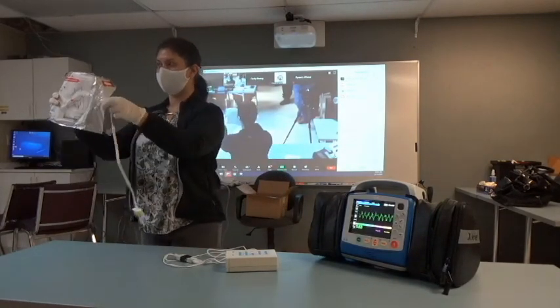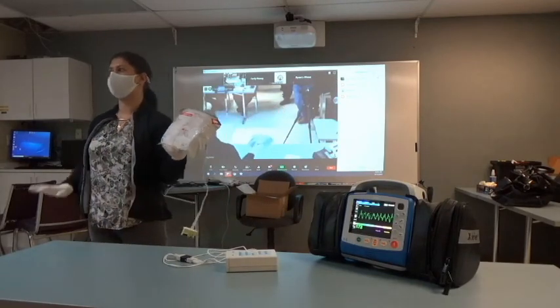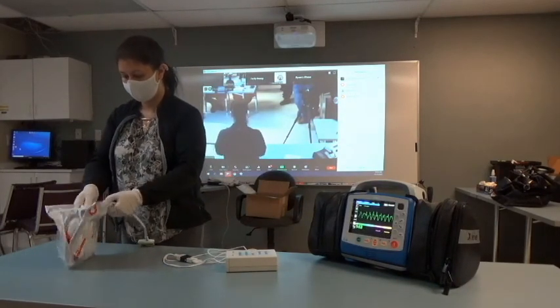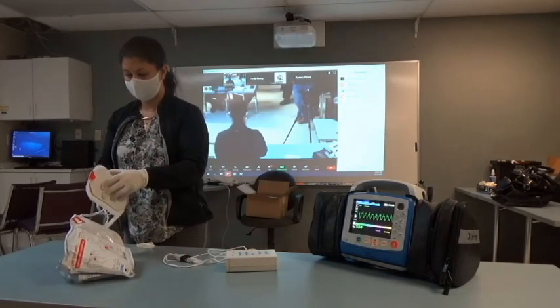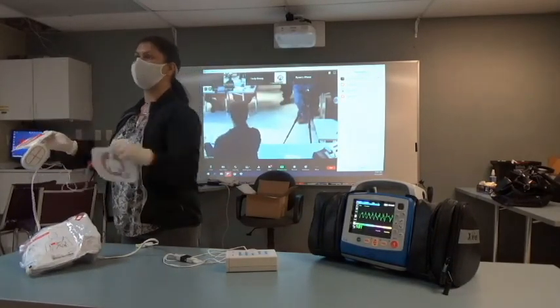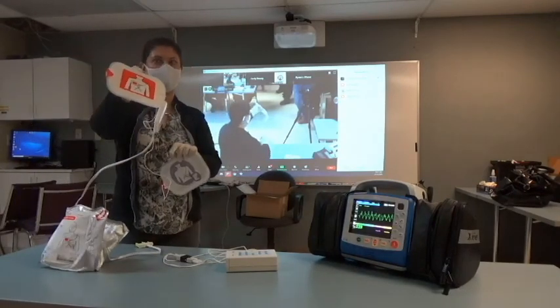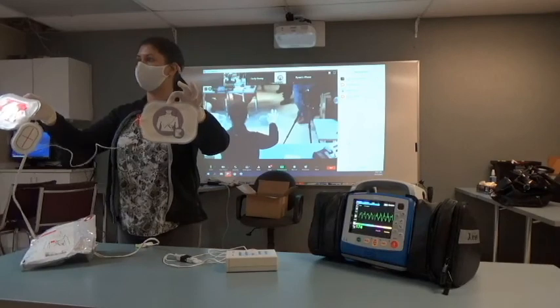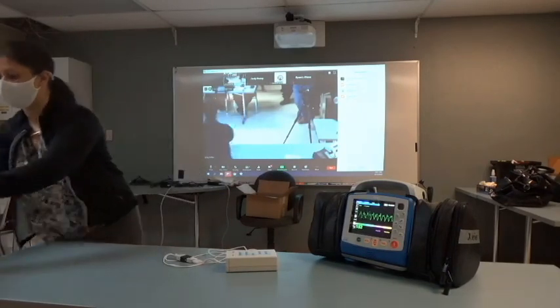So it's got the picture on here on the front, but it's a little deceptive because on this pad, which I'm gonna open up in just a second, the picture's showing that the puck stays attached, and that's not the case. When you open it up, you've gotta separate it. So your set of pads looks like this, red and purple, okay? This is perforated. You're gonna tear the puck away, okay? The puck is gonna go exactly like the picture shows you, but it's just gonna be separated, basically where your hand will be for compressions. Do you guys do front and back or anterior, anterior, just like this? Okay, perfect. And I'll leave that out if anybody wants to look at that afterwards.